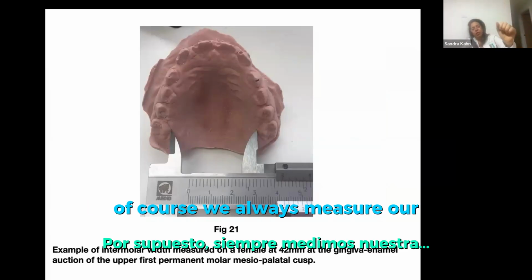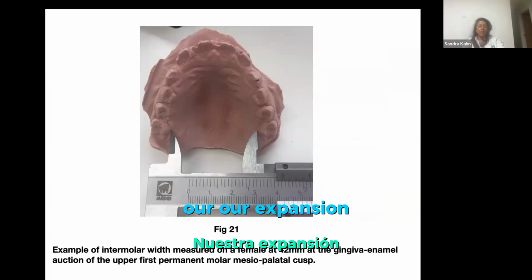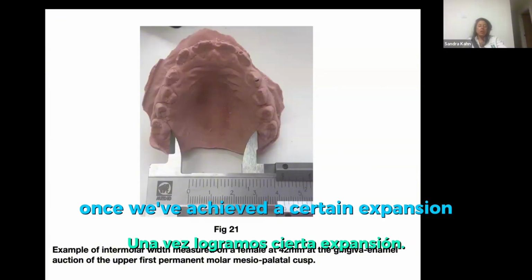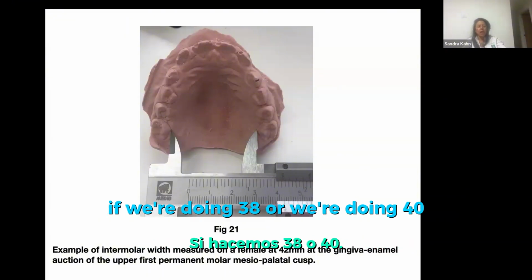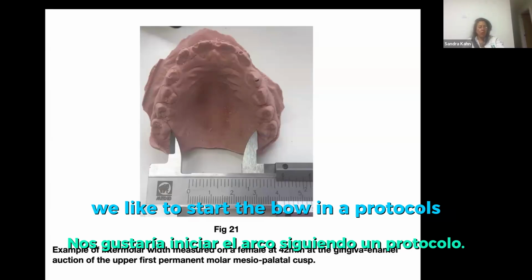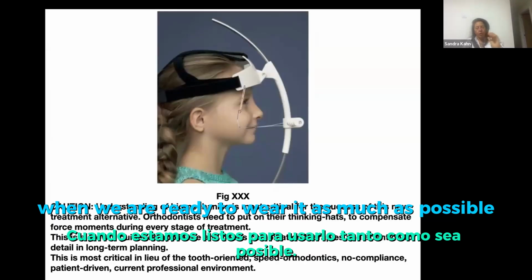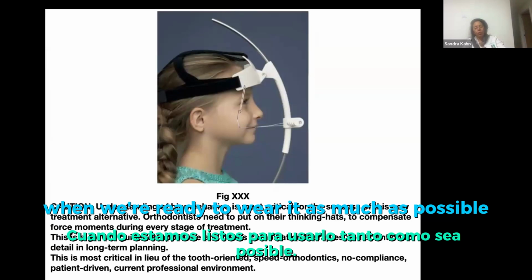Of course, we always measure our expansion, and we always recommend using the bow once we've achieved a certain expansion. If we're doing 38 or we're doing 40, whatever we're doing, we like to start the bow. In our protocols, the bow goes in when we are ready to wear it as much as possible. When we're ready to wear it as much as possible, we go for it.